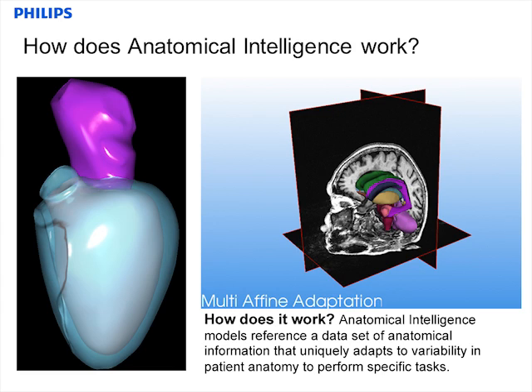Each patient's organ has characteristic landmarks that are common as long as they develop normally when they were born. Over time, pathology can change the size and other characteristics of the organ, features attributed to the disease process. AIUS works by collecting organ feature data over hundreds or even thousands of patients with different conditions. It then can use an algorithm to adapt certain atlas shapes to the patient's organ in question by using various computer vision algorithms. AIUS can use some interaction by the clinician to select certain feature points so that it does the tedious work of multiple tracings, or even it can work without any user interaction at all.